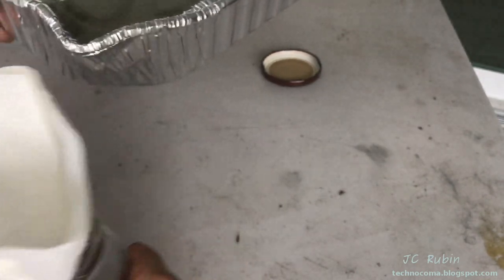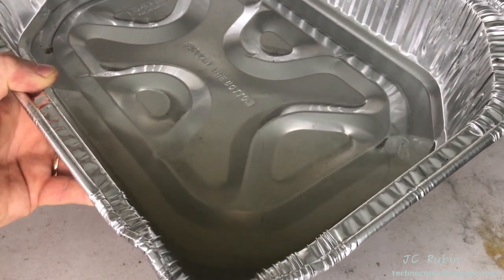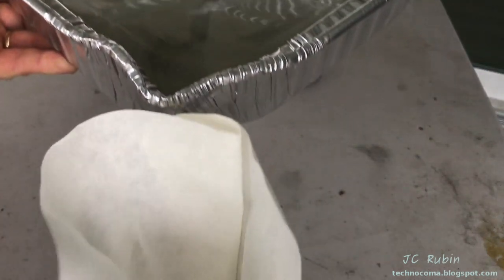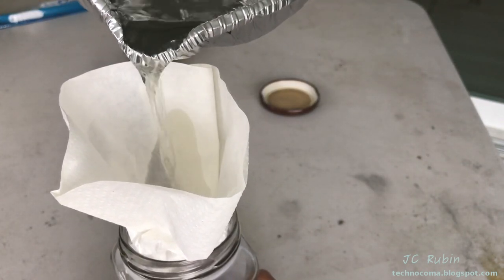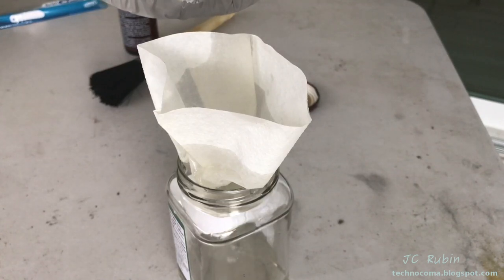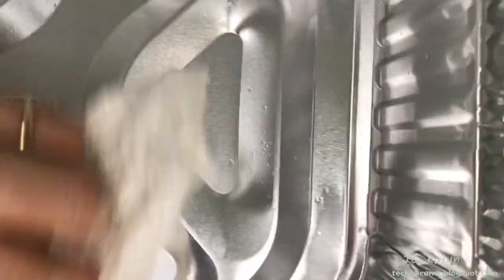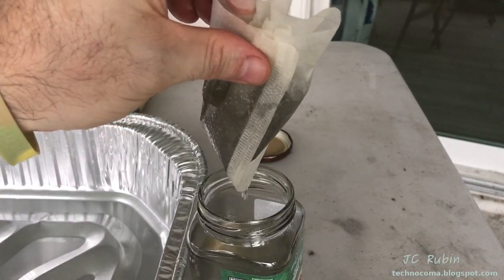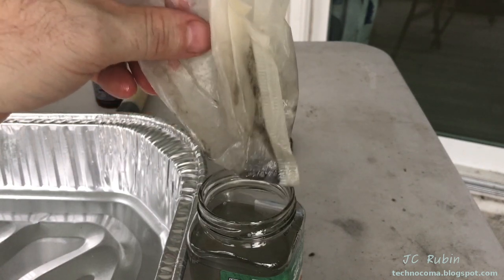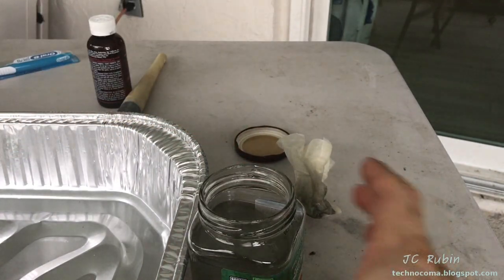I decided to filter the kerosene before continuing because it's nasty — dark and full of dirt. I don't want to use that dirty fluid to clean things. So I filter it through the coffee filter back into the pan, also cleaning out debris from the bottom of the pan with a paper towel. We're not going for sparkling clean, but we're not trying to put dust and hair right back into what we just cleaned.